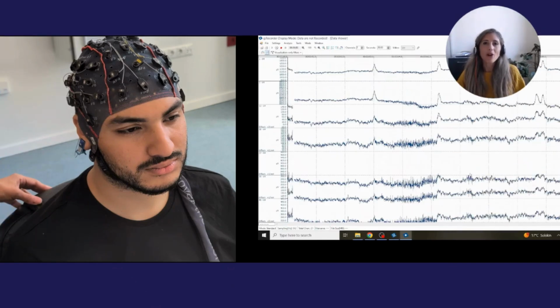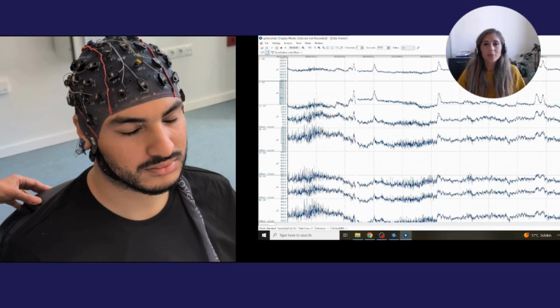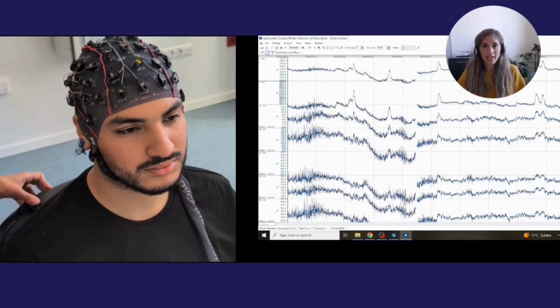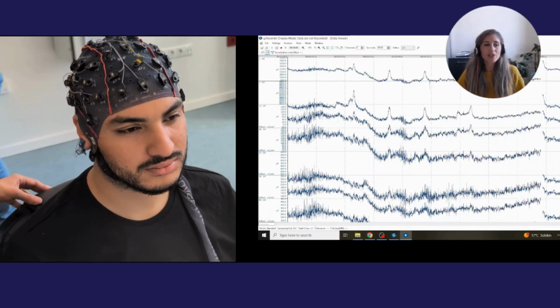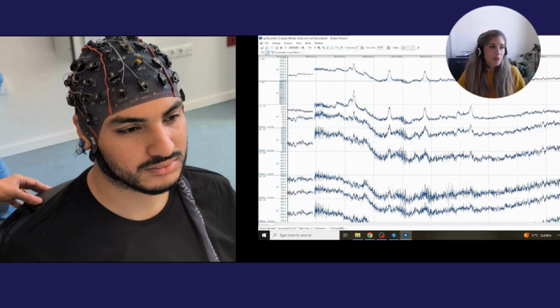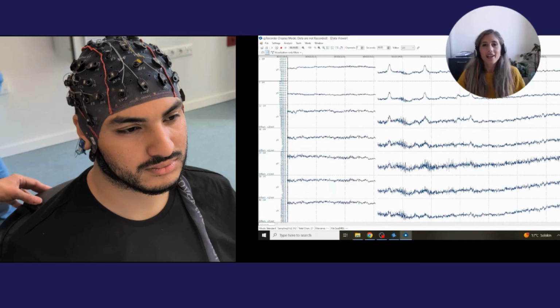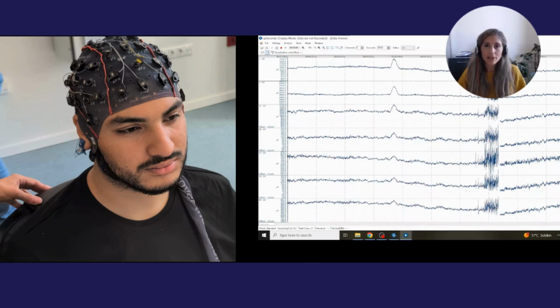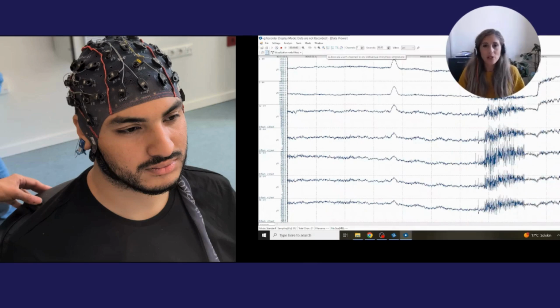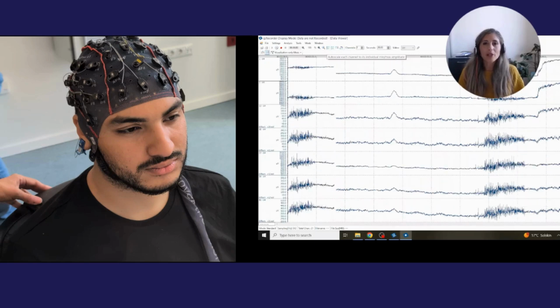Some very common types of artifacts are created by blinking or the movement of the eyes. These appear as large waves, especially in the frontal channels, as you can see in the graph on the right, in the top part. They are created by the electrical field generated by the movement of the eyes, especially the relative field from the cornea and the retina.